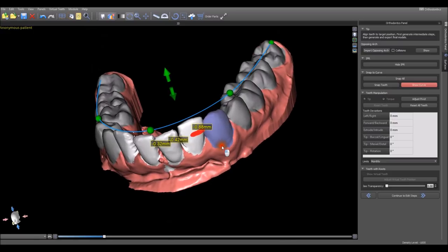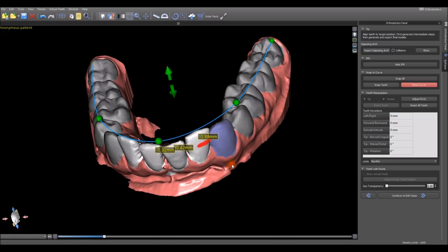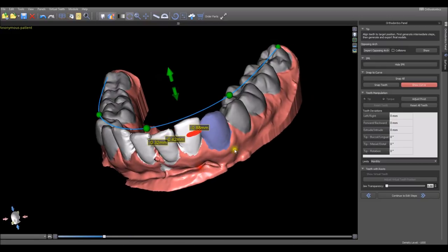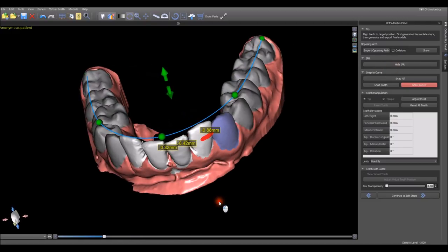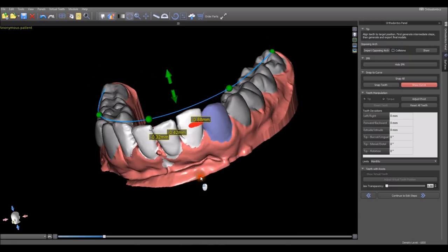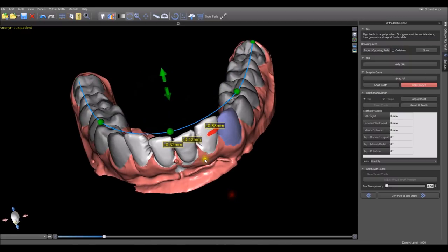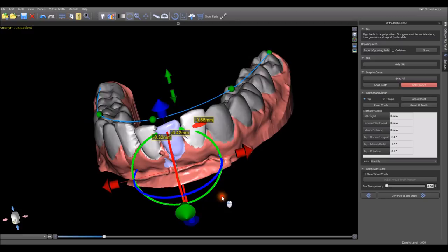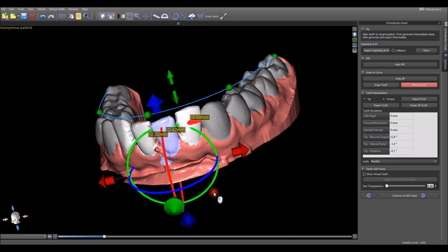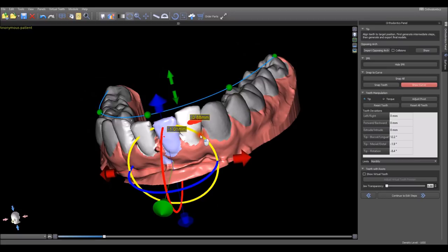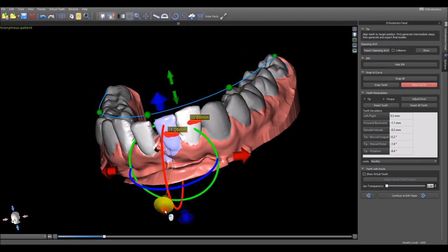What appears on the screen are the IPR values. If we want to hide those, we could simply click Hide IPR, or we could keep them active on the screen. If we want to fine tune the placement and manipulate the teeth on our own, just click on one of the teeth and we have the widget that shows up on the screen, allowing you to rotate the tooth and move it in any direction.